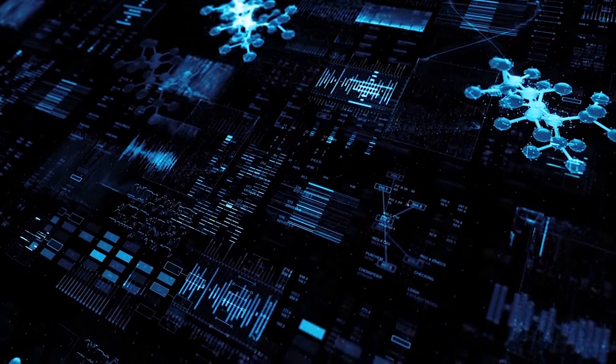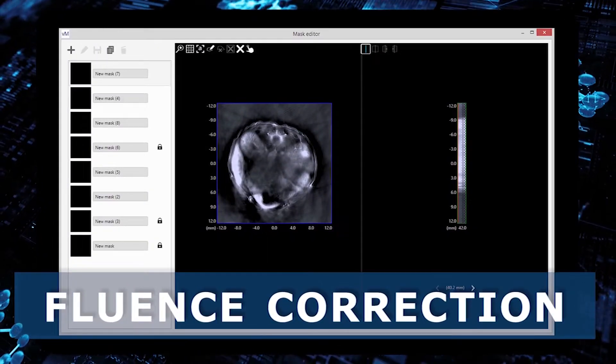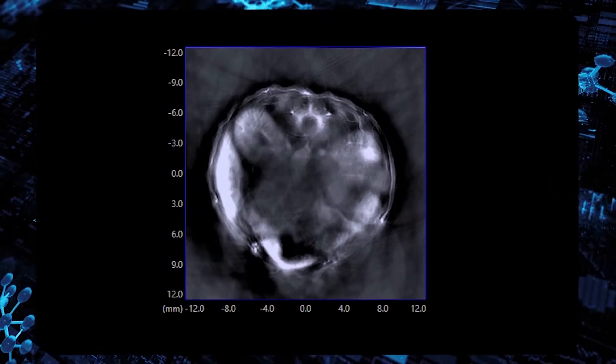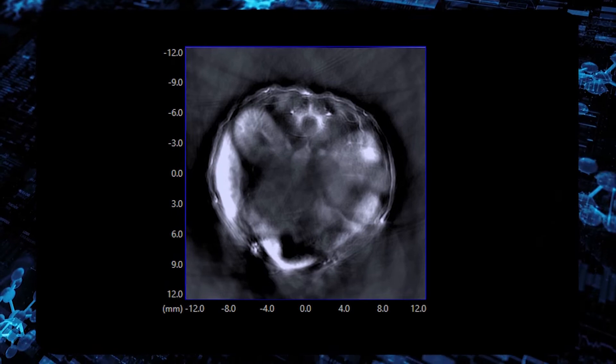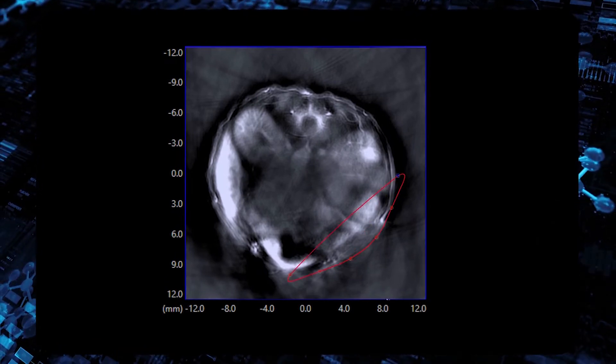The next processing step is fluence correction. It allows the adjustment of images for fluence decay inside the tissue.